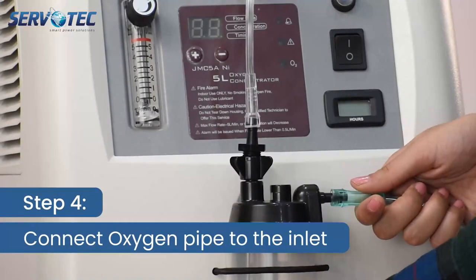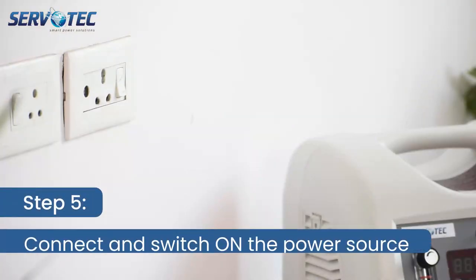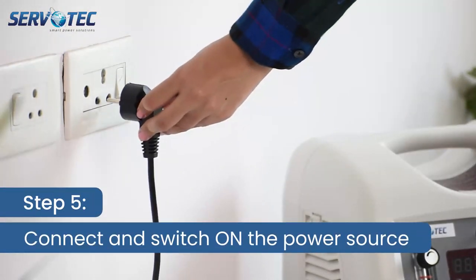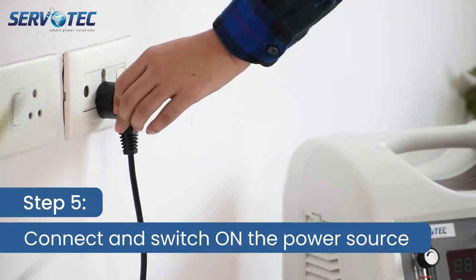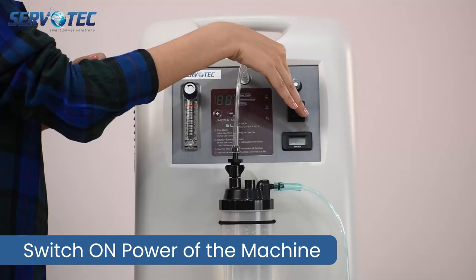Step 4: Connect the oxygen pipe to the machine as shown. Step 5: Now connect the oxygen concentrator to the power source and switch it on. Switch on the power of the machine.